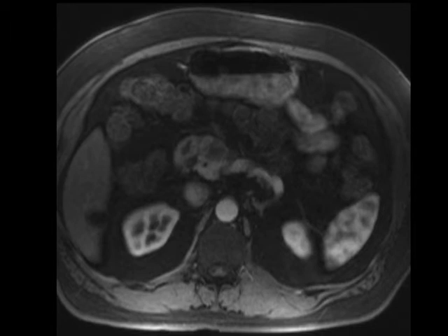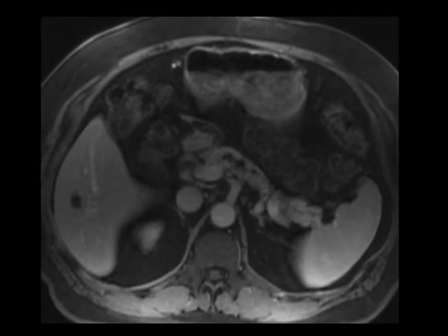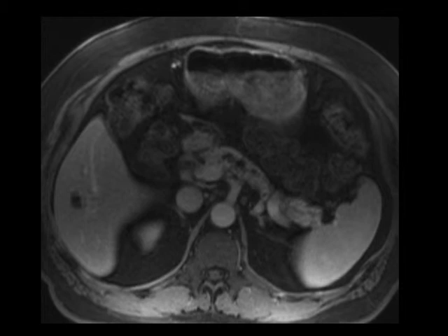This first case is an interesting application for MR. Often we think of pancreatic adenocarcinoma as a diagnosis we primarily make on CT, and I think that's true. But MR does have a role in certain specific indications, particularly when you have a lesion that's hard to see on CT, or when you're trying to exclude a lesion in a patient with low index of suspicion on CT but high clinical suspicion.